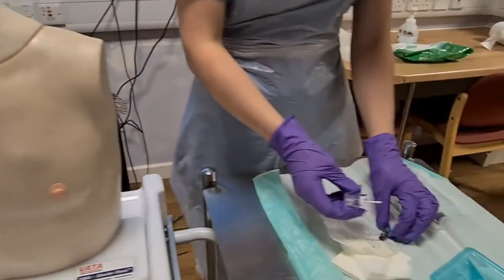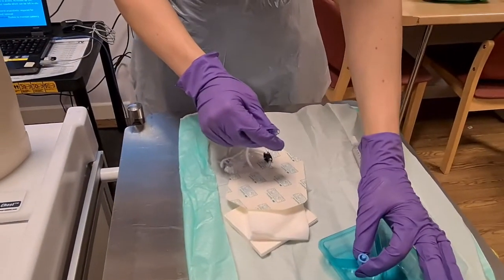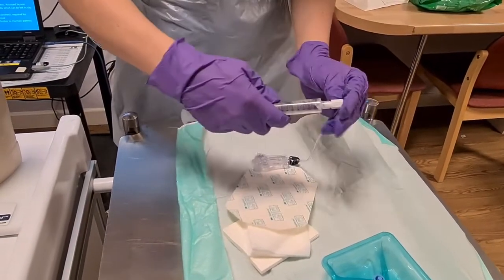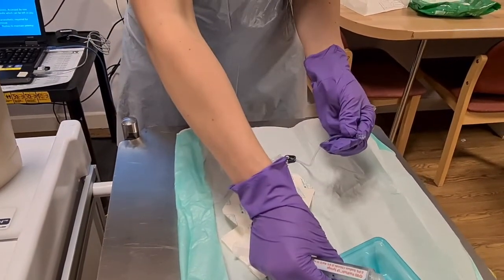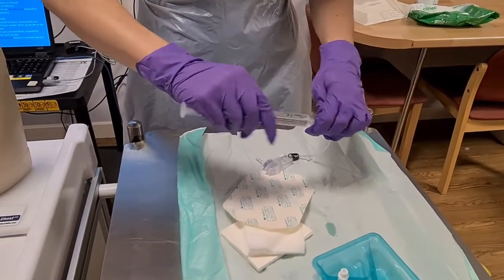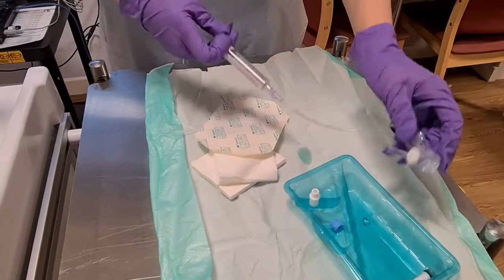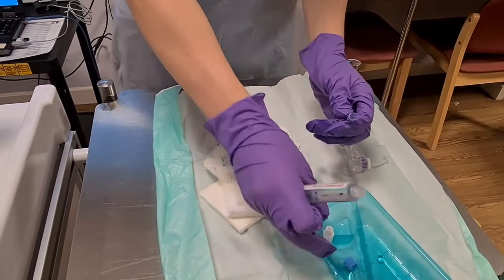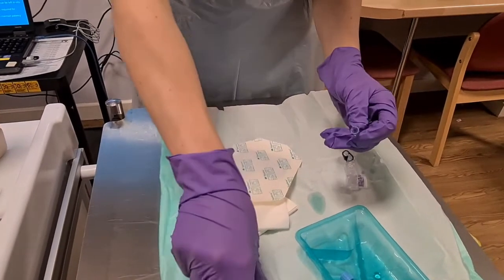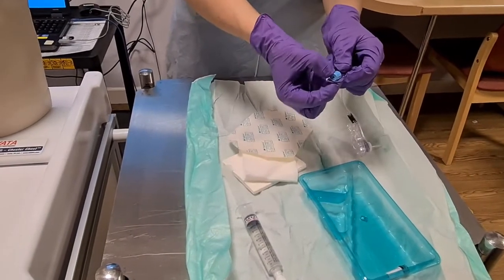Now what I would like to do is flush the line. So I'm going to continue to use standard ANTT and surgical ANTT, so I want to protect my key parts. So placing them on the side and just flushing them. That's it. Protecting them as much as possible, so non-touch. And placing that on like so.